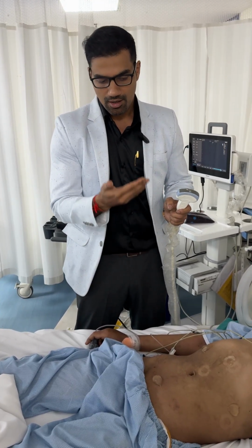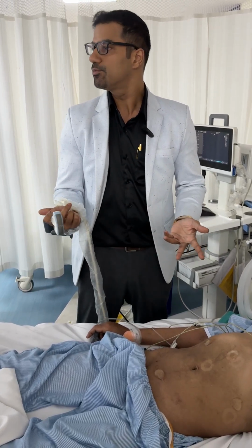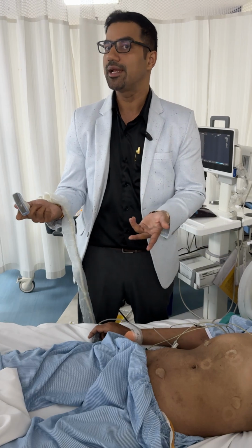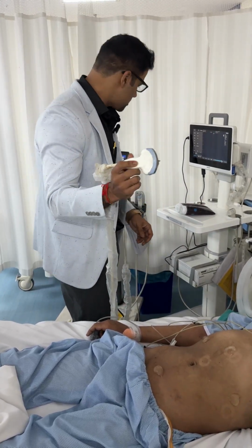Whereas for FAST and the E-FAST, you don't need to put anything. You just need to put the probe, and it has a good sensitivity of almost 93 to 96%. So definitely a good sensitivity.